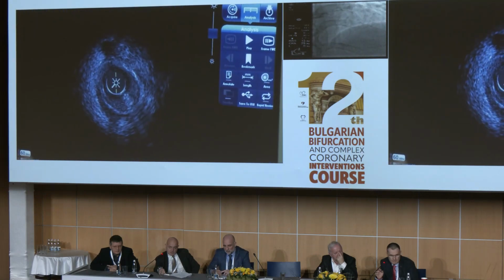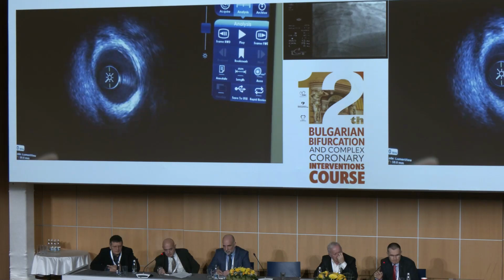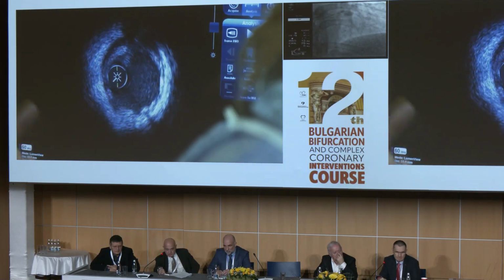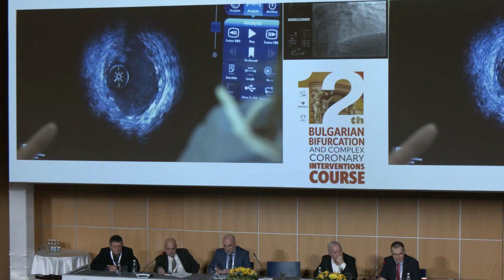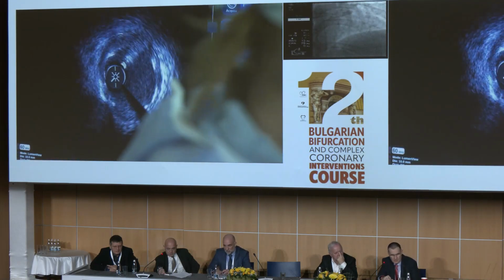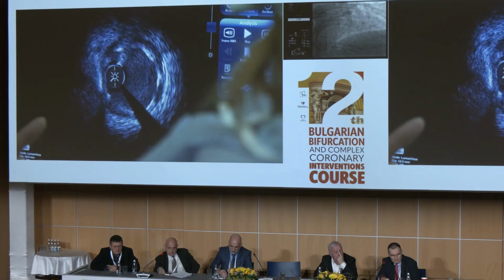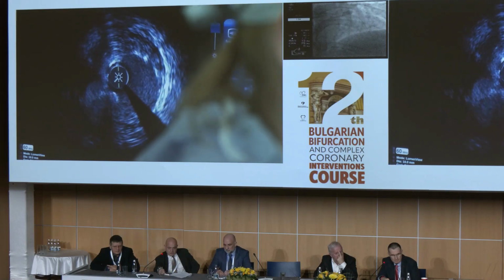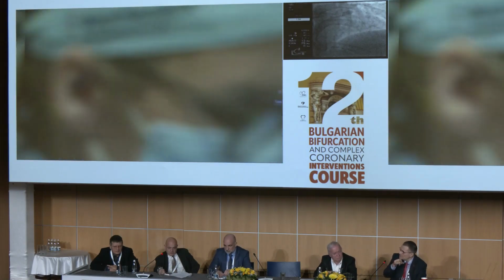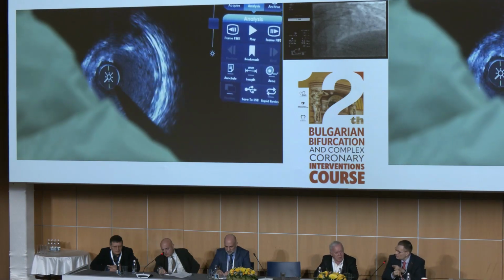For me it was important to highlight with this pocket technique that you invented that we are not deforming the distal part of the stent. Absolutely, and I find it extremely smart. It would probably deserve some position in the next bifurcation club consensus. This is the wire, outside the proximal part, so you also see the wire.